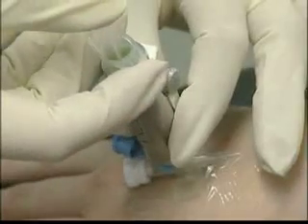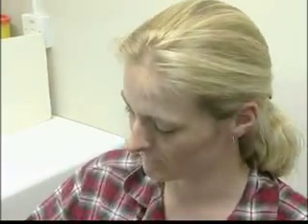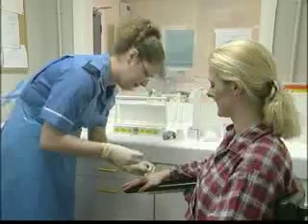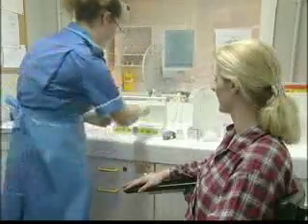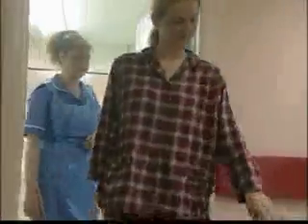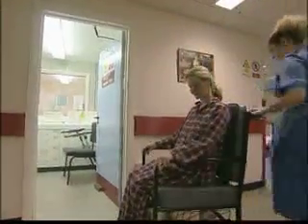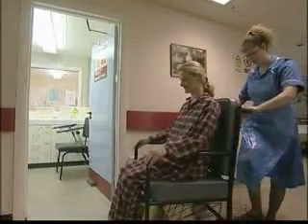A lead-covered syringe offers protection to the personnel performing the injection. The time between the injection of the radiopharmaceutical and imaging depends on the specific procedure. In some cases, imaging is carried out immediately; in others, there can be a delay of several hours.